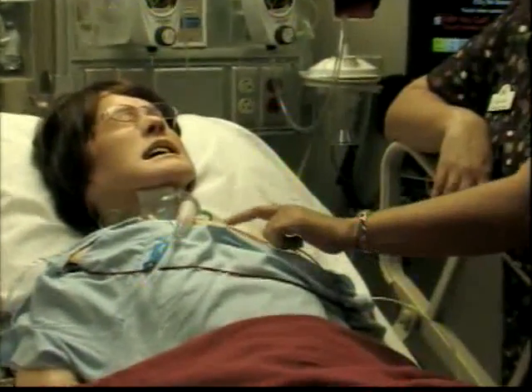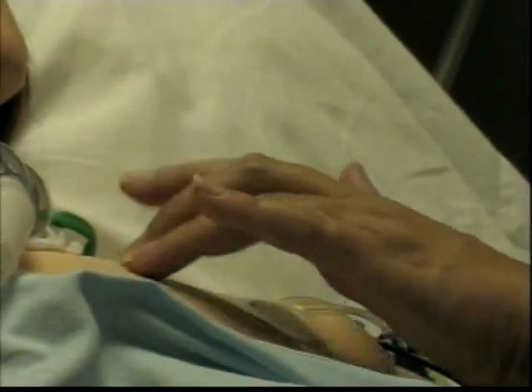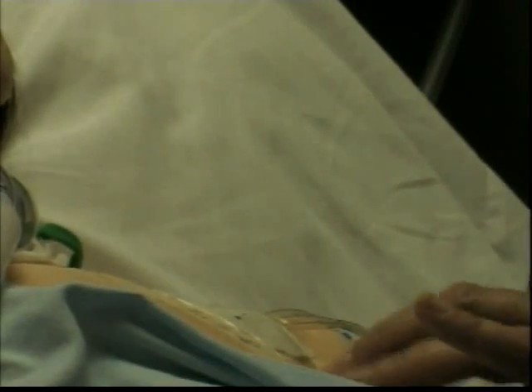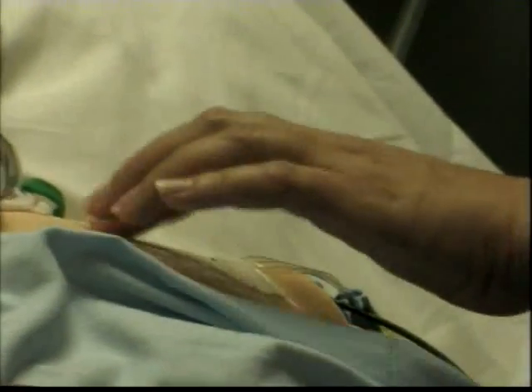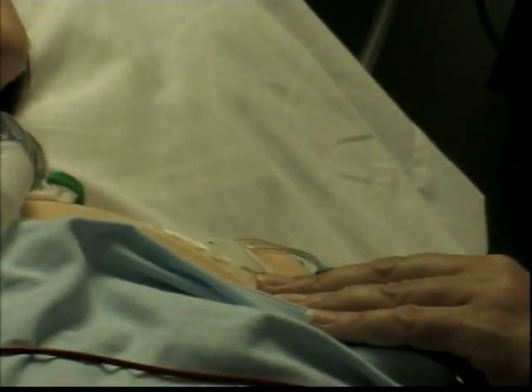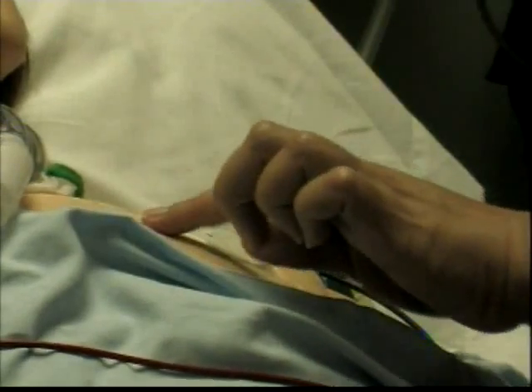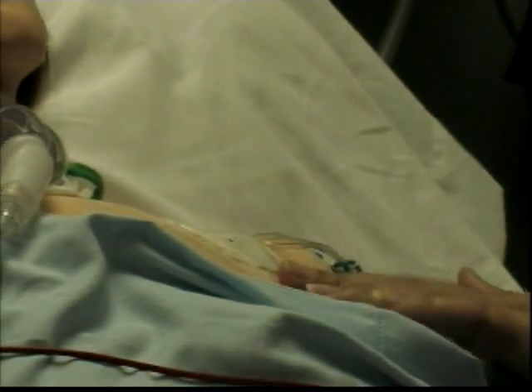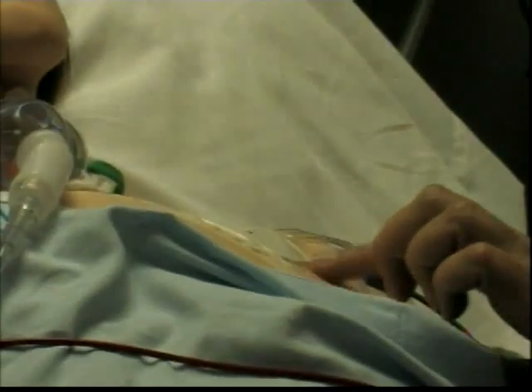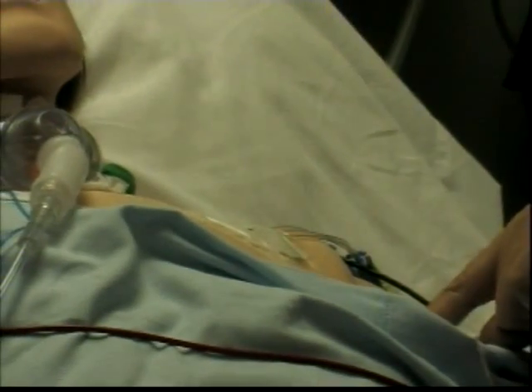Are there any little ulcers or redness around the site? Do you feel and touch around the site, and want to make sure that there is no crepitus, there's no fluid underneath there that can indicate that there's infiltration. You're looking for redness, for swelling, for tenderness, and that will be more phlebitis. It's an infection right at the site. So you will perform that assessment before you take that dressing off.